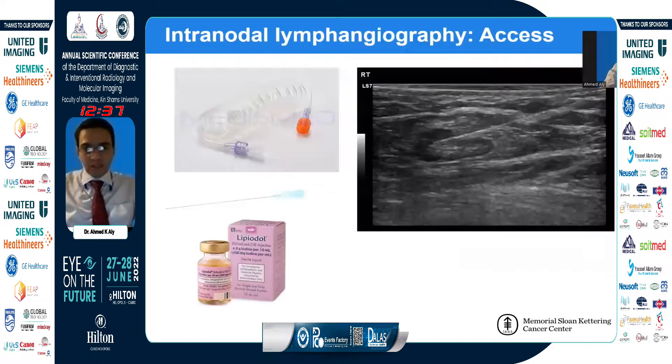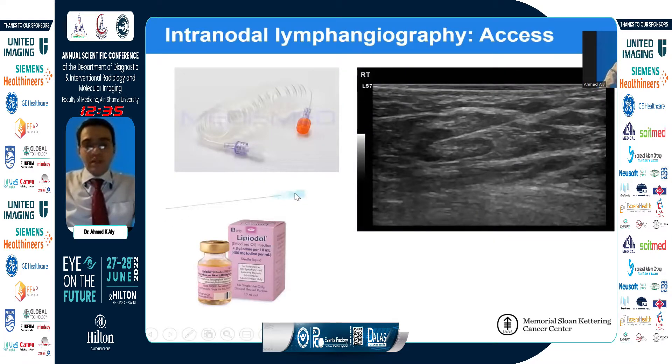So how do we do this? We use a needle, usually a 25 gauge needle, because it has to be thin. It has to be a little bit long so that it can go through a long subcutaneous tract, which adds stability to our access. We locate the tip within the corticomedullary junction of the lymph node, and then we start injecting the lipiodol.